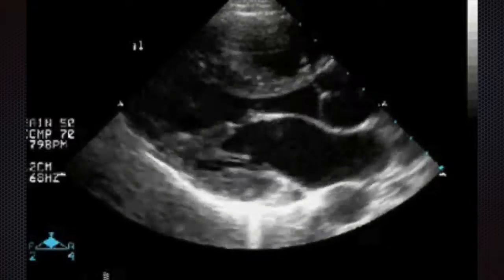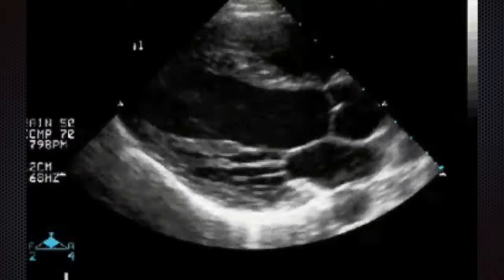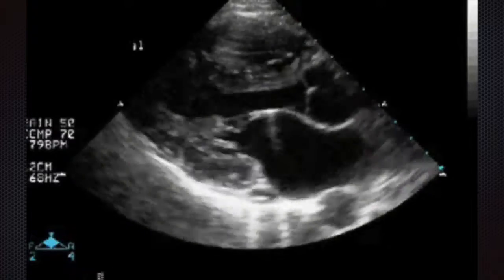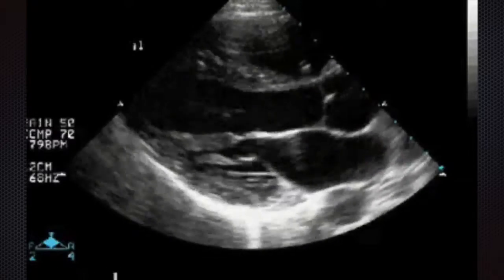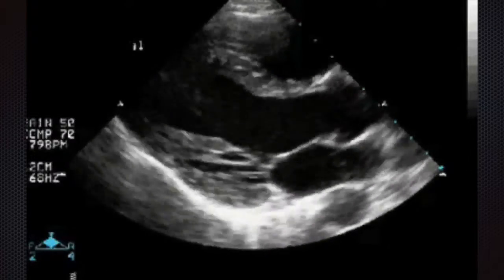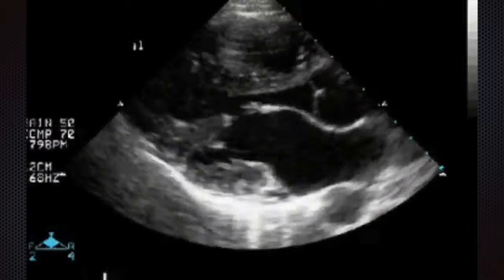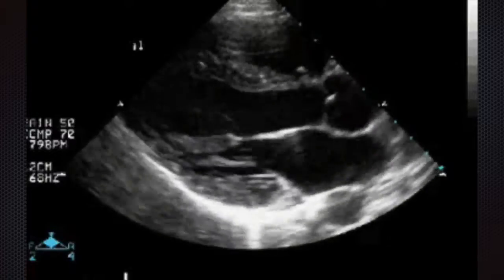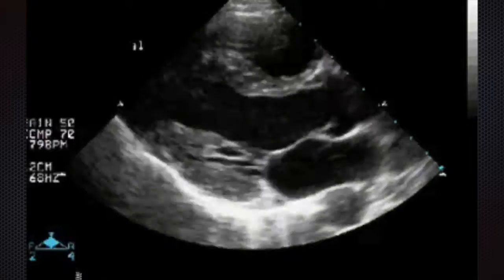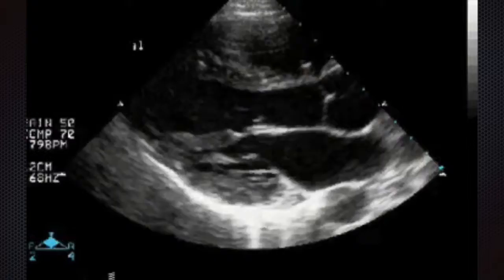Okay, so when blood's been pumped out of the left ventricle, it's going to go through the aortic valve. So we can see the aortic valve, it's at the middle right of the screen, and it's opening and closing. And this shouldn't look as thick as a mitral valve. So really anything more than about 1 millimeter of thickness is usually abnormal. And you can see that the valve, pretty much when it closes, is closed essentially in the middle of the aortic outflow tract.